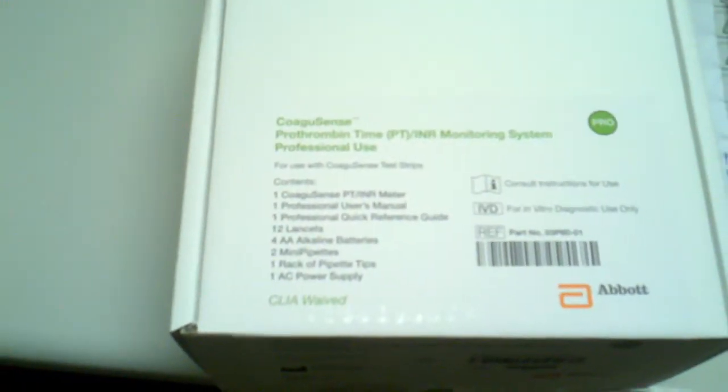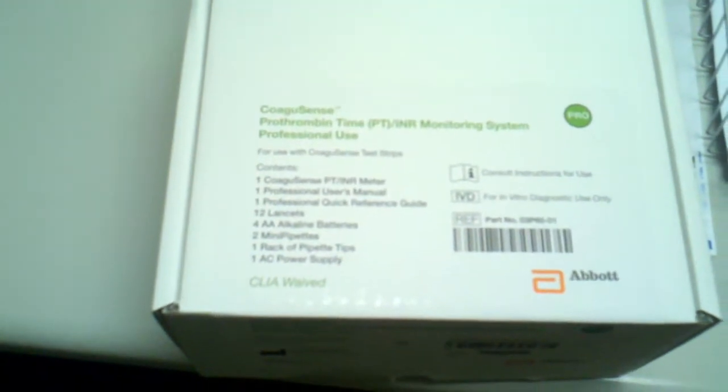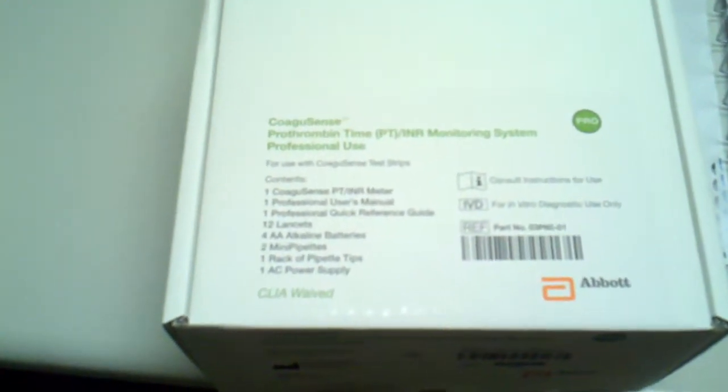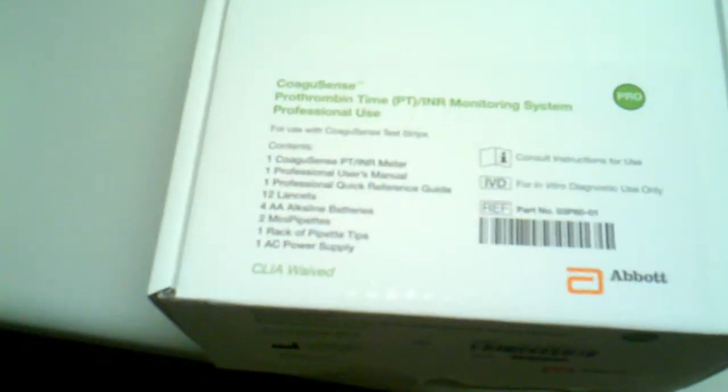This is GoSouthernMD.com's tutorial on the CoaguSense PT-INR Monitoring System Professional Kit that we have listed on our website for $899.